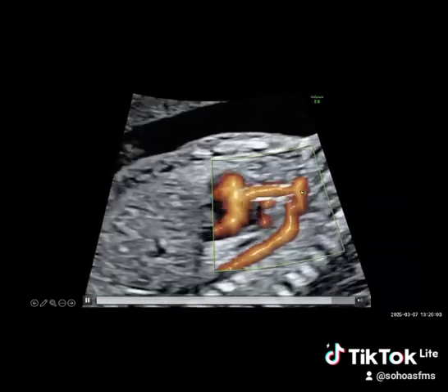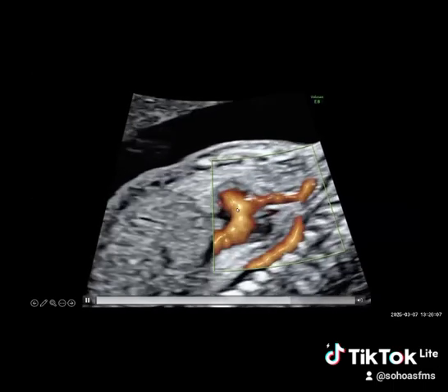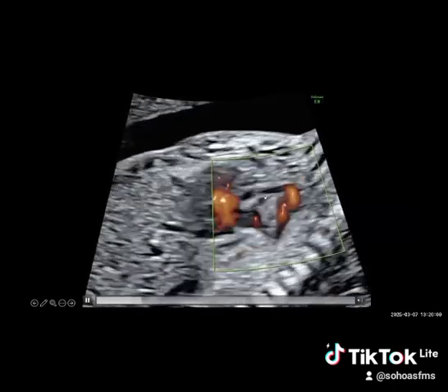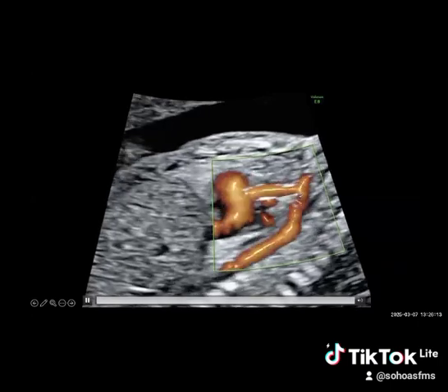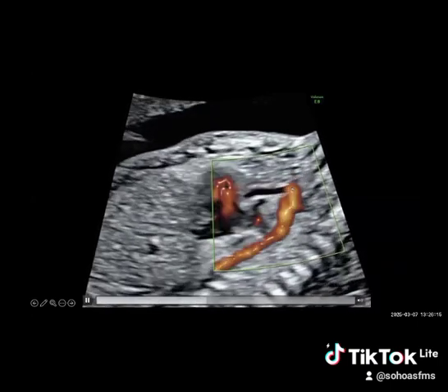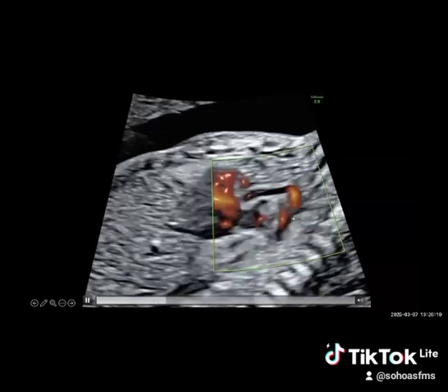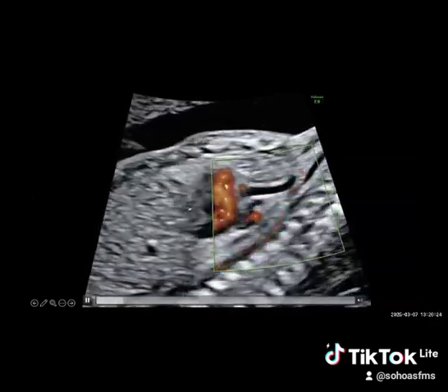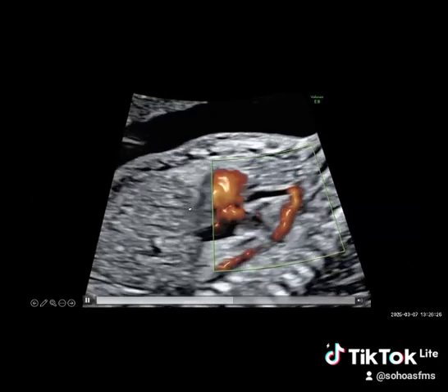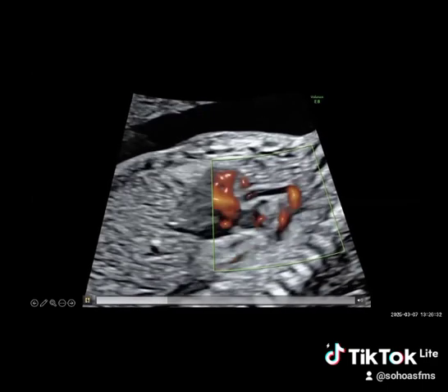And this is a recent patient of mine, which I put here because I think it's very clear that the aortic arch is very abnormal. This is with power Doppler because I wanted to highlight how tortuous and hypoplastic the ascending aorta is. It's a sort of angulated, Gothic arch. I think there is some flow persisting that starts after the first branch, a very clear posterior shelf, and diffuse arch hypoplasia. This baby also has a bilateral superior vena cava with a left SVC to the coronary sinus. And I am following up this baby.